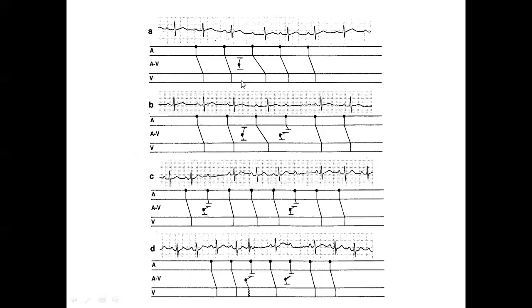Which did not manifest into the ventricle or to the atrium. So from the surface ECG, you don't see the existence of a junctional premature beat. We call it completely hidden from the surface ECG. And they use the term concealed. So concealed junctional premature beat is affecting the AV junction in such a way that when next P is going to conduct, it's going to take longer than usual time. So concealed junctional premature beat affecting subsequent beat, causing PR to be transiently lengthened.